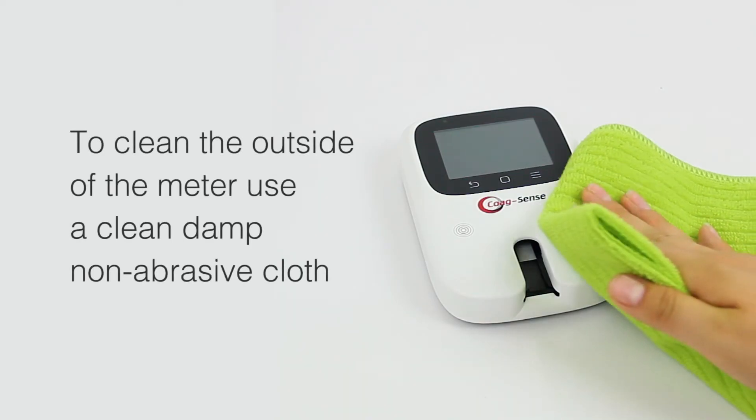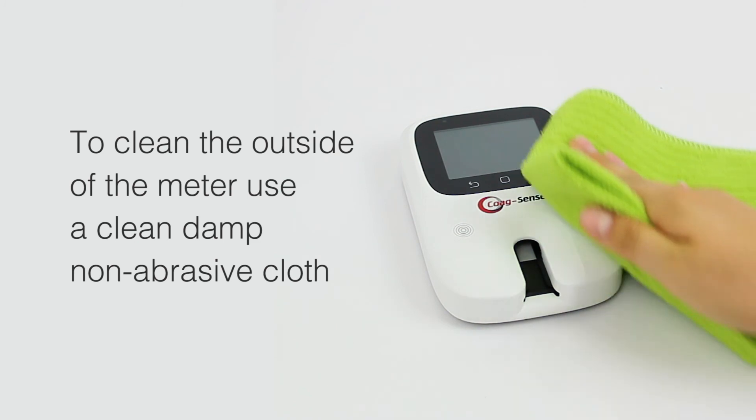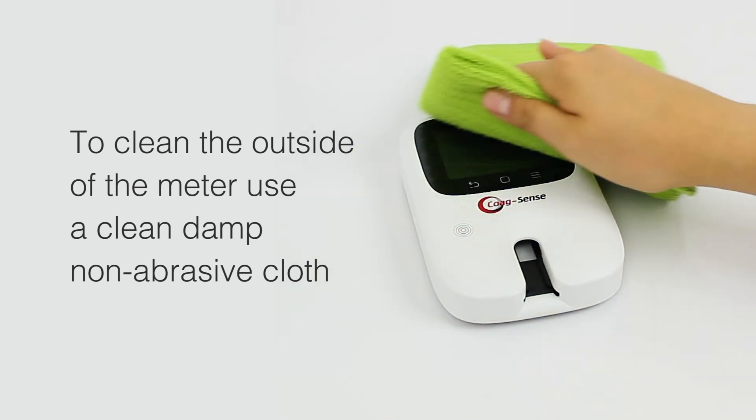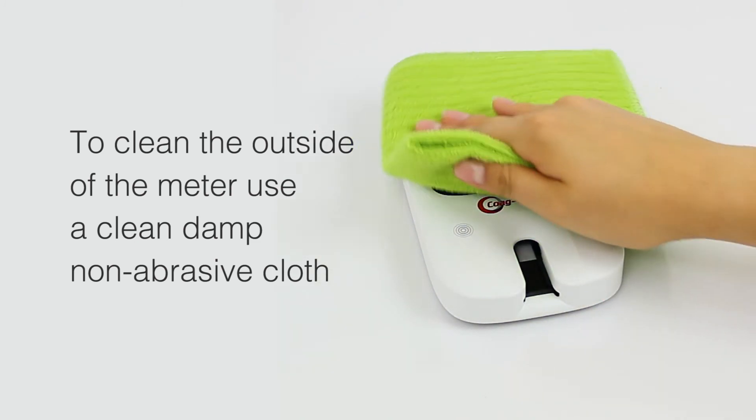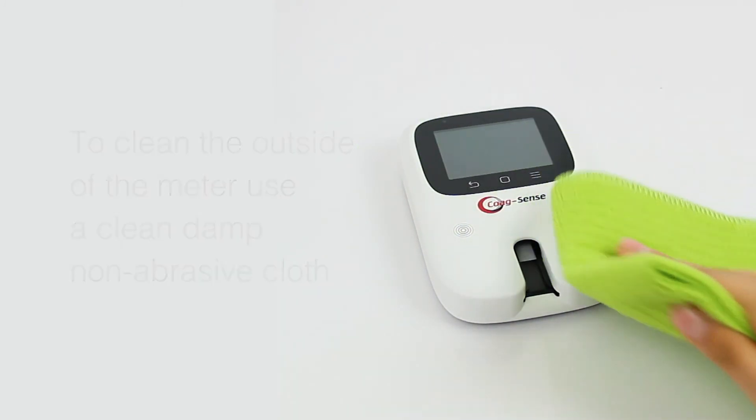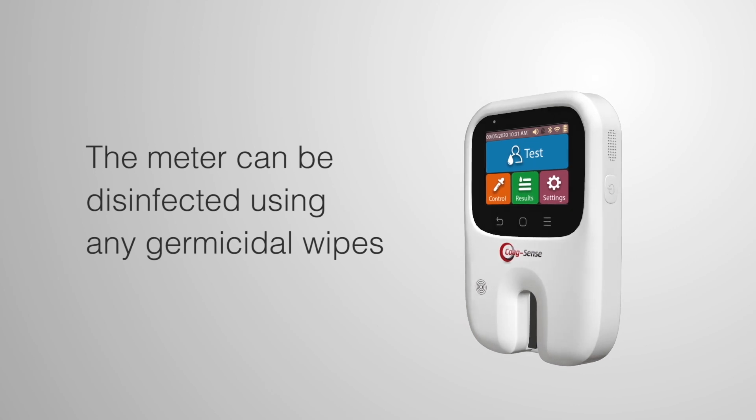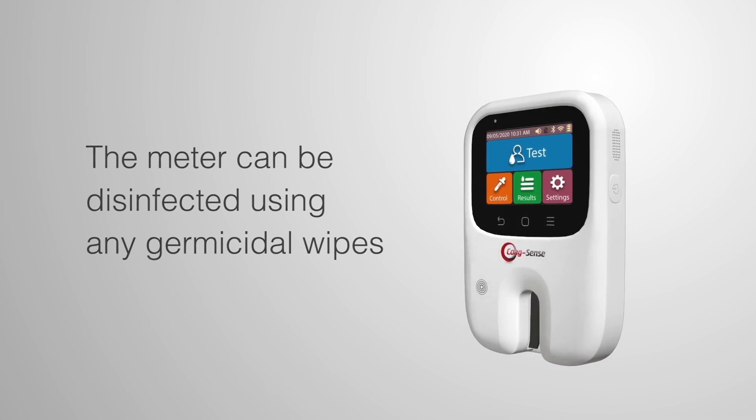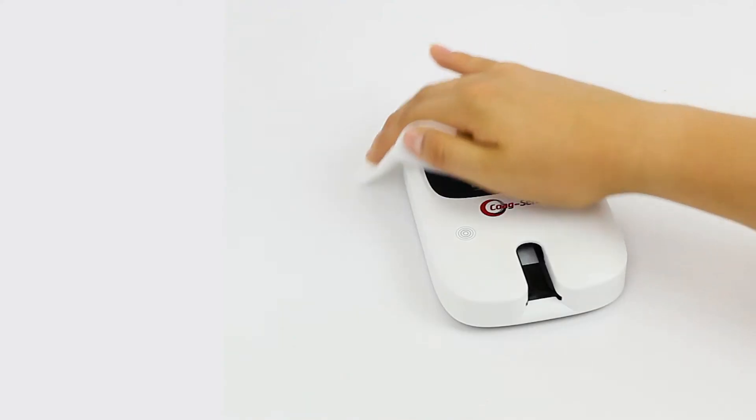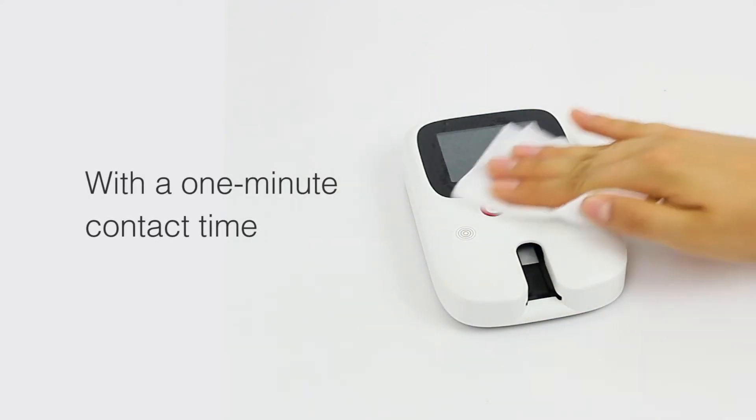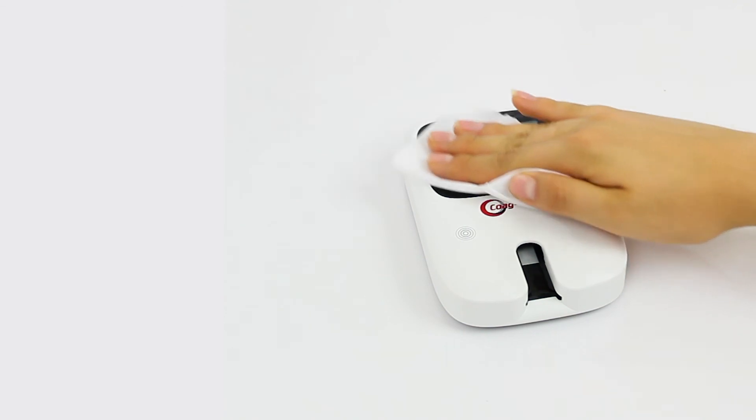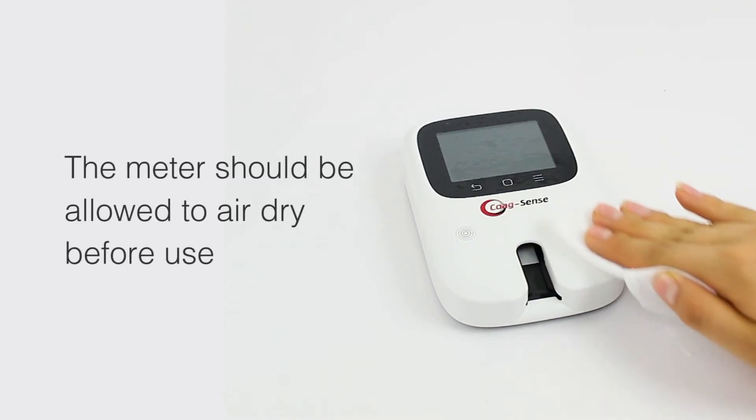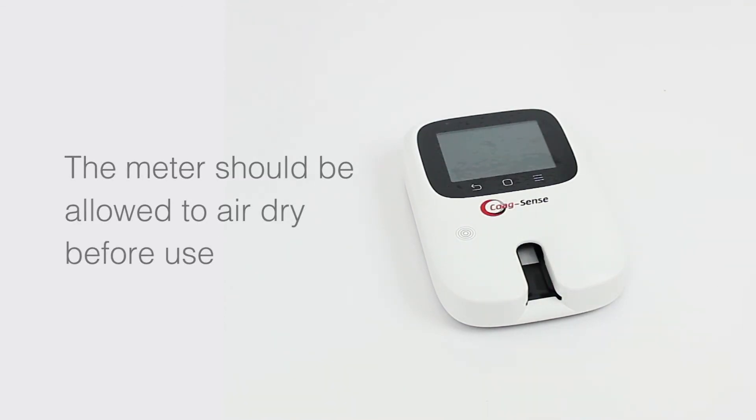To clean the outside of the meter, use a clean, damp, non-abrasive cloth. The meter can be disinfected using any germicidal wipes that have 0.55% sodium hypochlorite or 10% bleach solution with a one-minute contact time. The meter should be allowed to air dry before use.